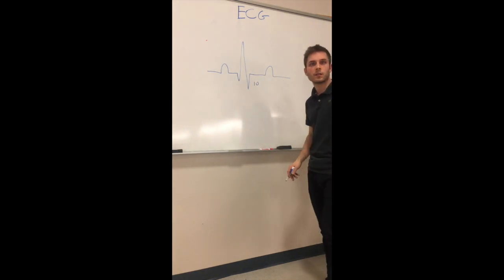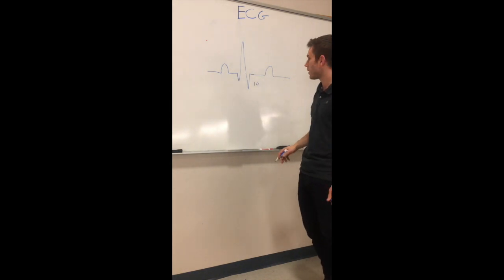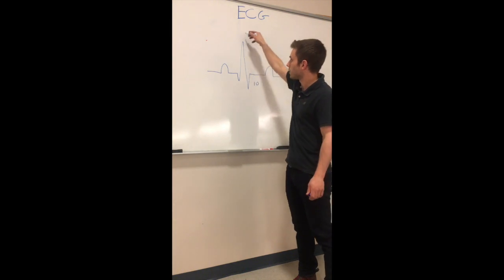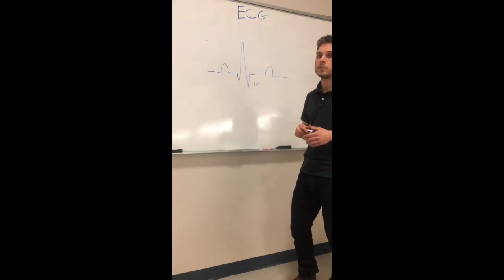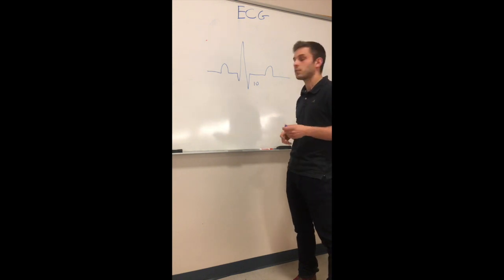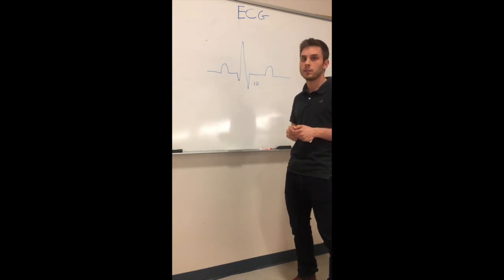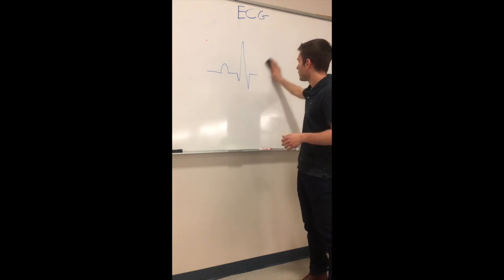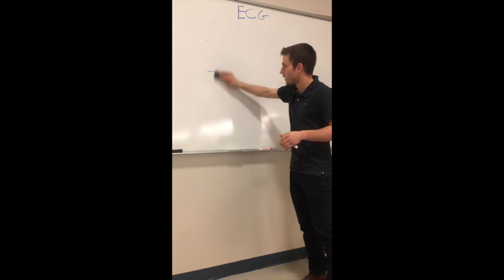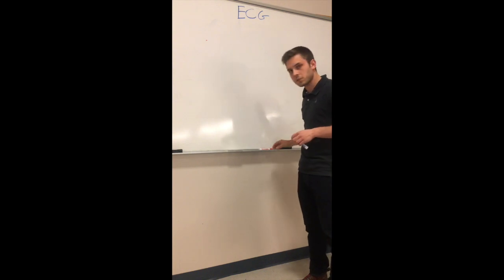And then you calculate the height of the R wave in V5, so you calculate this segment, and if that's greater than 35 millimeters, you might have left ventricle hypertrophy in your ECG trace. Again, we can go through that in more detail when we actually get into the lab, and there's a good example in your lab manual.